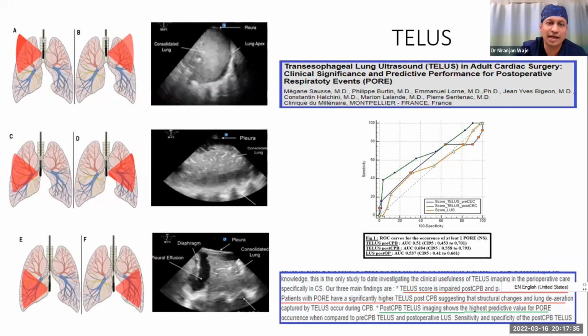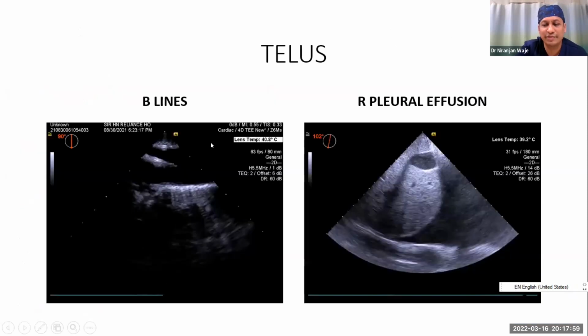the heart. So normally this is A, B. This is a first set of readings, second and third. If the probe is on the top at the aortic level, this is the first set, and the second set of readings is at the mid-esophageal four-chamber view level, and below is the deep transgastric level. And if you turn the probe to left and right, you interrogate the left and right pleura. So what information can we get out of this?